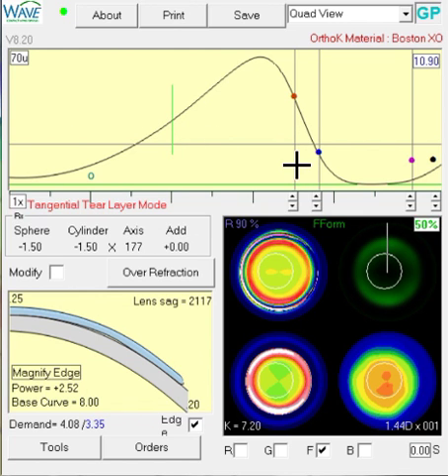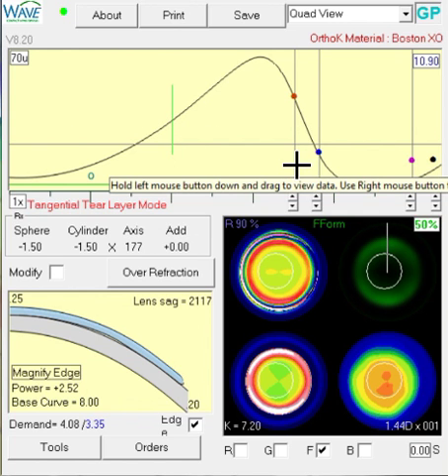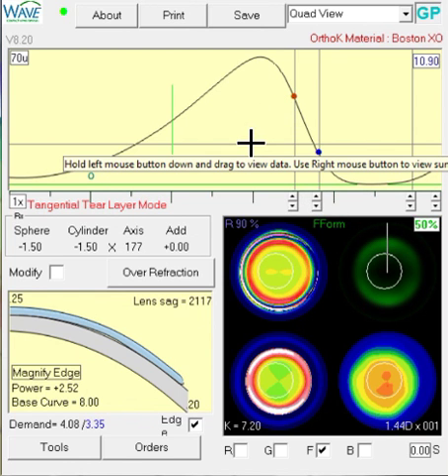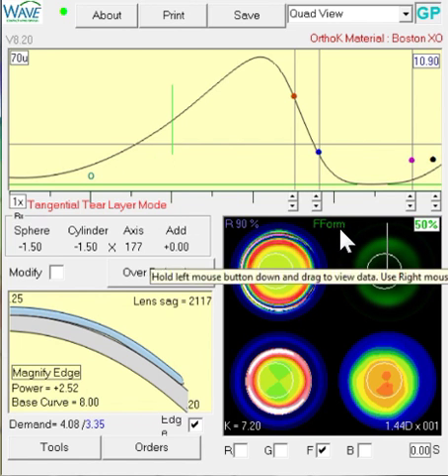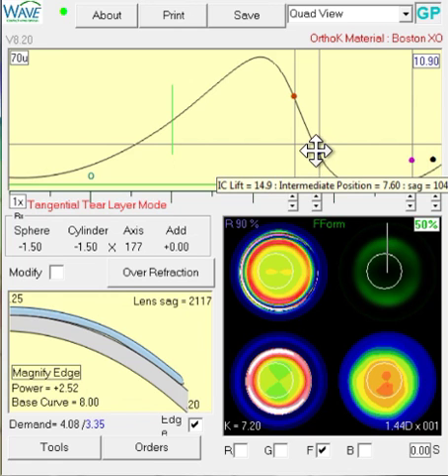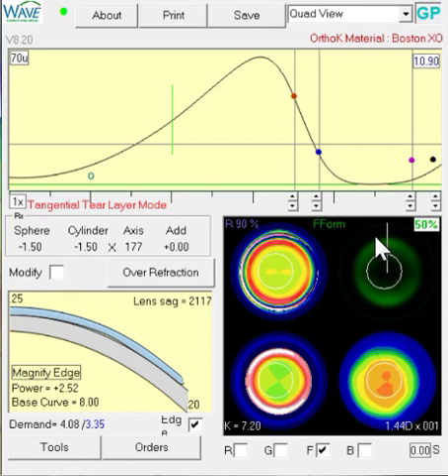But in this case, I think we can go either way, maybe even try one approach for either eye and do a little sample of one experiment for yourself. Regardless of which strategy you use, the last thing I would do is really make sure we seal off in the vertical meridian. So I'm going to write, it's a little bit cut off on the video here, but we have an initial sagittal depth of 1046 right now. I'm going to bump this up to 1056 and just make sure superiorly and inferiorly we're landing on the cornea.